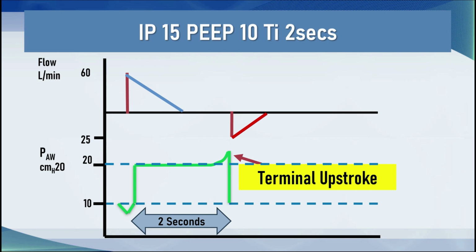Normally, one exhales immediately after inspiration. And at most, inspiration only takes a second. Hence, the patient always wants to exhale. And this is what you see when the patient tries to exhale in a pressure assist situation and the breath is being held in the lungs.